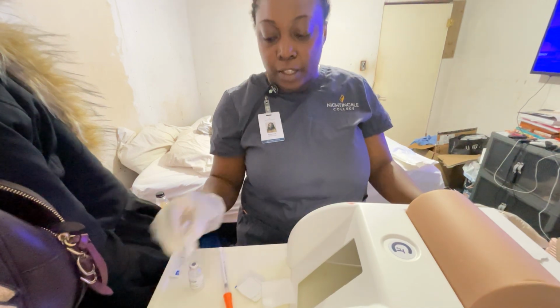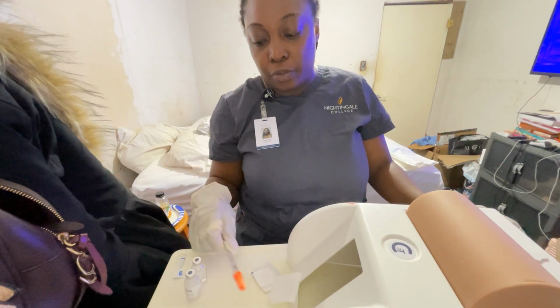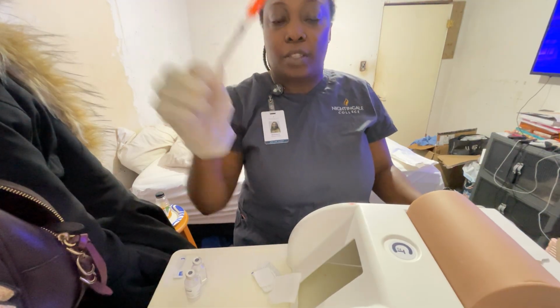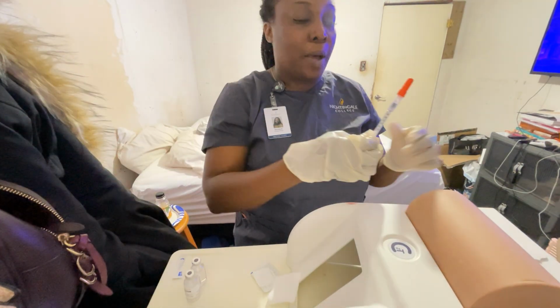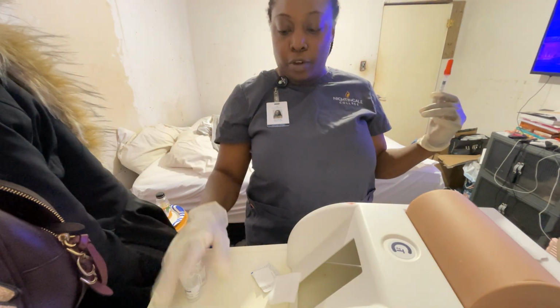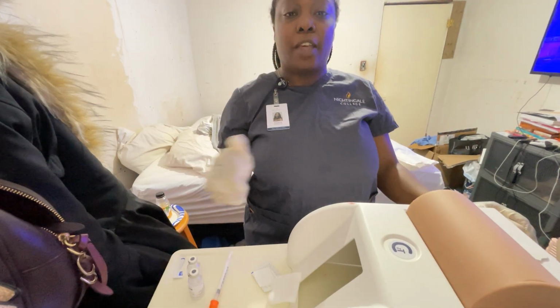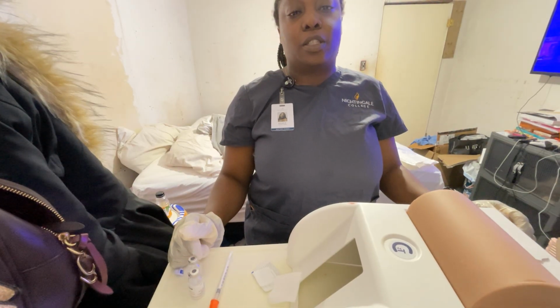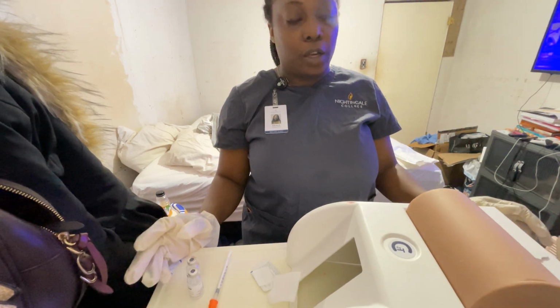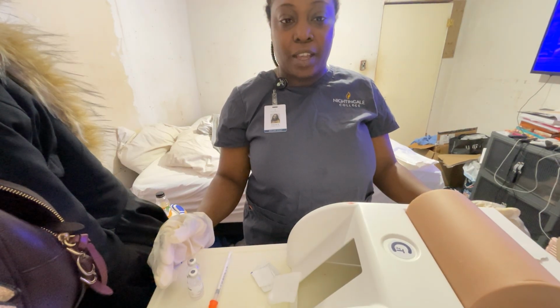Okay. All right. So I have successfully drawn up 12 units of insulin, which I have here. And I have my second nurse verify that yes, we do in fact have 12 units of insulin, 4 units of regular acting, 8 units of the NPH. My patient has been educated on insulin and how much they were receiving, and what the normal parameters are for the blood sugar. That's it for this video. Thank you.